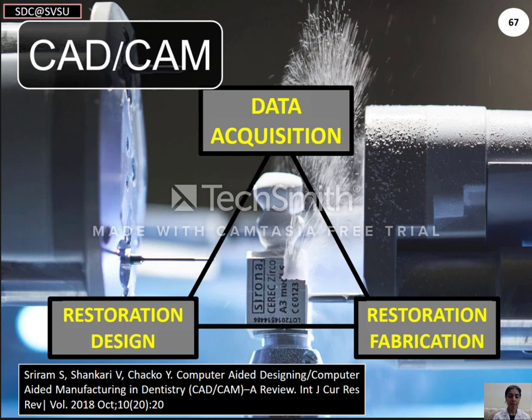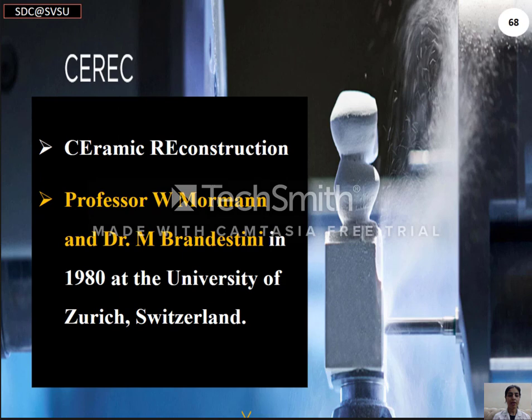Starting with CAD-CAM, it has a triad of data acquisition, restoration design, and restoration fabrication. Beginning with CEREC, which stands for Ceramic Reconstruction, it was introduced by Professor W. Mörmann and Dr. M. Brandestini in the year 1980. In today's era, crowns can be fabricated even in a single day. I would like to show you a video showing the same.